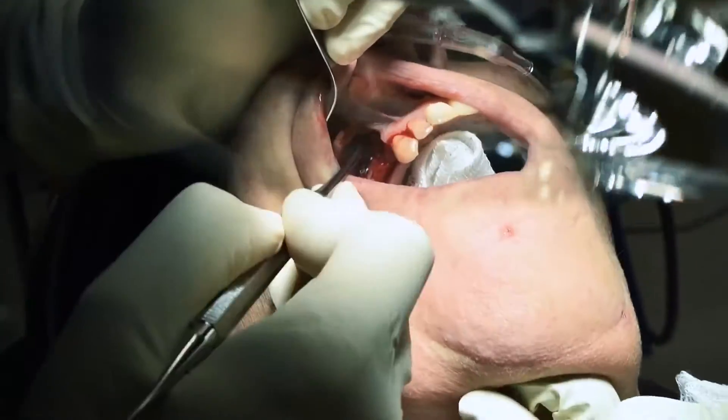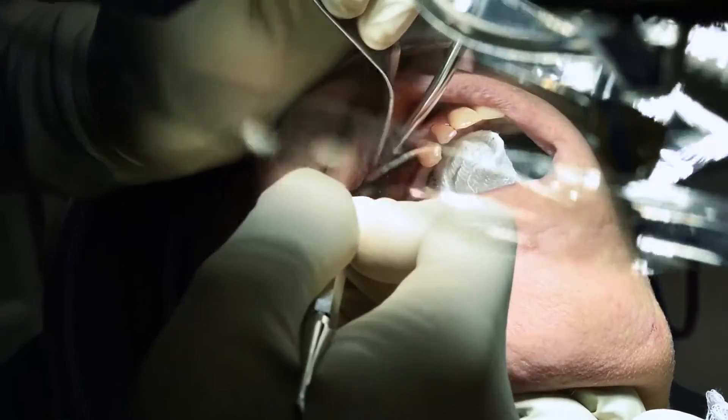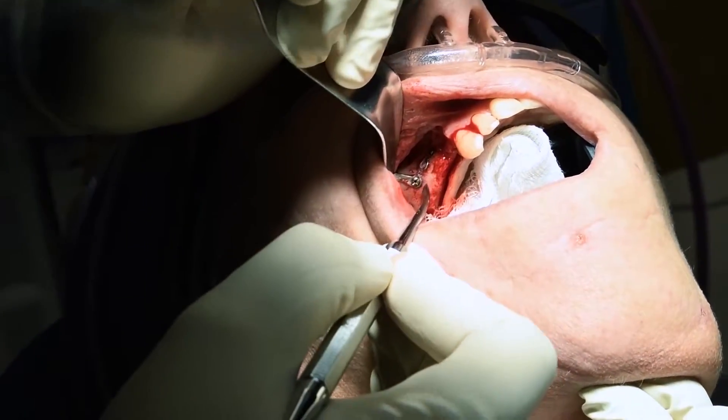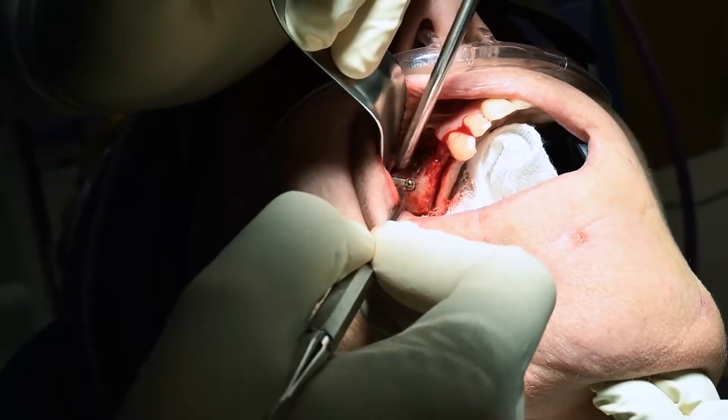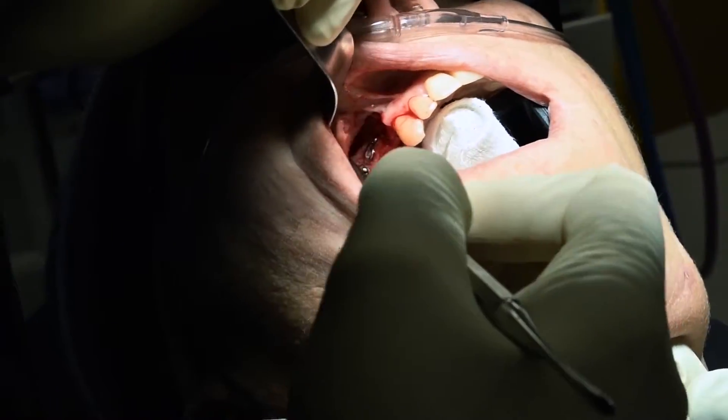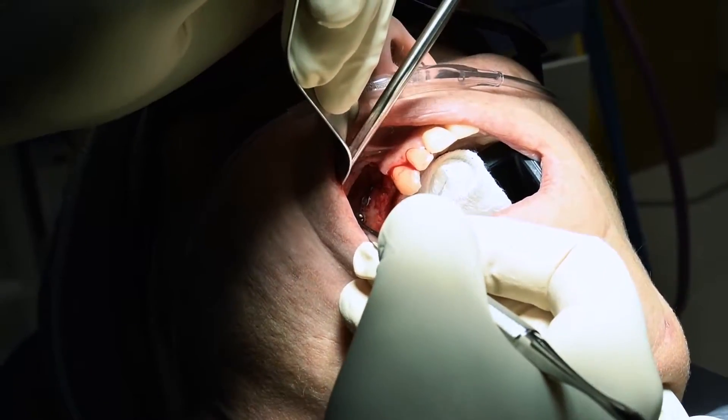What was her injury? I think it was a zygoma fracture — cheek bone fracture. Yeah, but I don't know the mechanism. So this goes really far up there and I haven't even reached the screws yet.